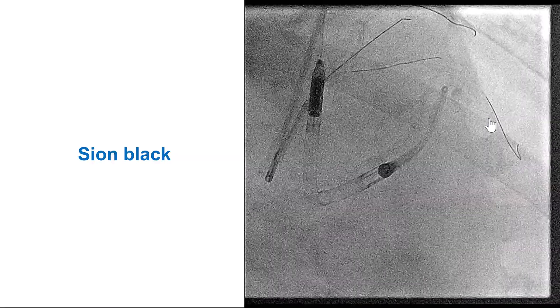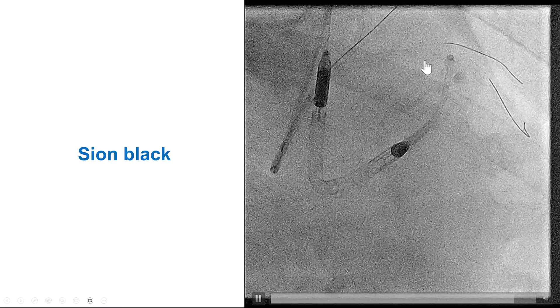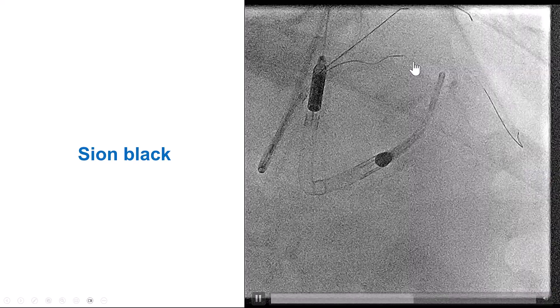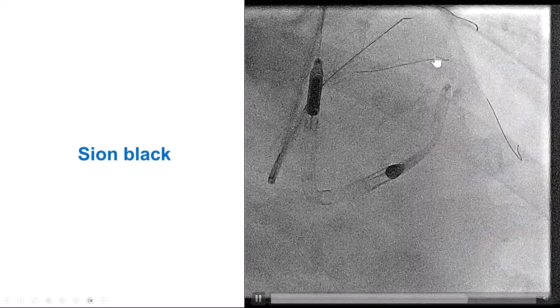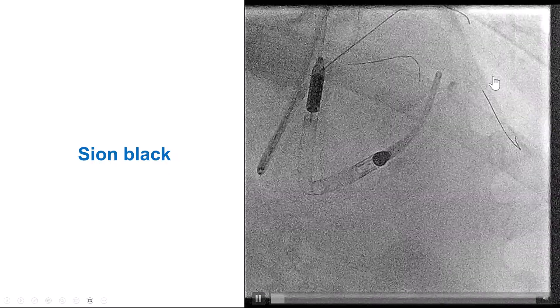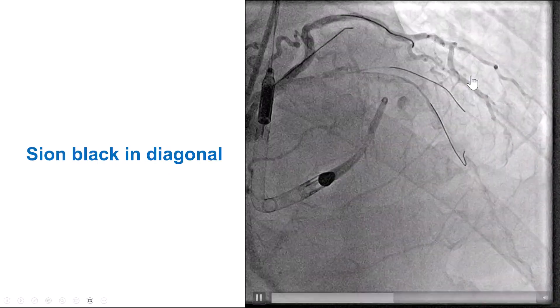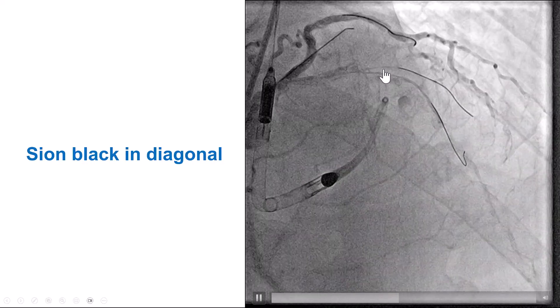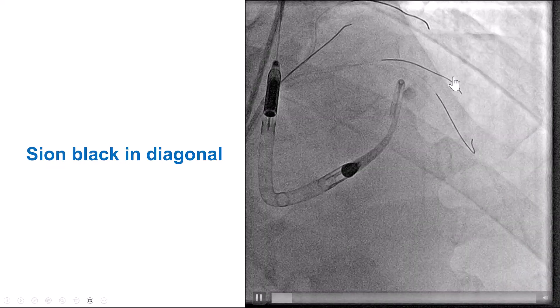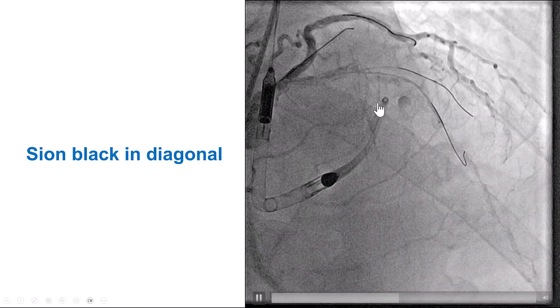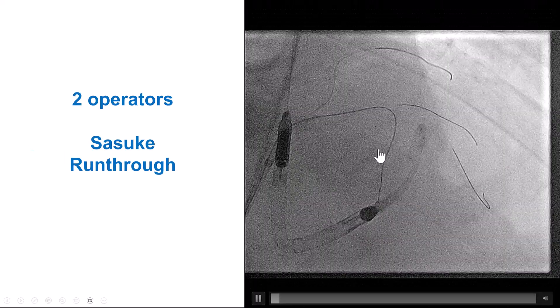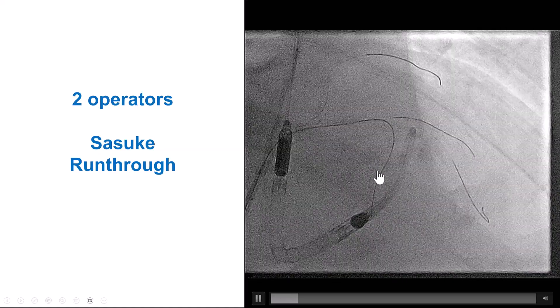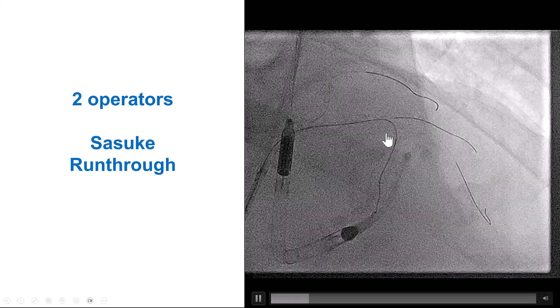At this point, considerable time had passed and we were seriously contemplating stopping. Before doing so, we took the wire on the septal and probed gently with it. Fairly quickly, the wire buckled for a second and then found its way into a branch that looked like a diagonal branch. When we checked with contrast, we confirmed we were in a small diagonal branch located at the distal cap — we had a wire into the true lumen in the diagonal. We were then able to place another wire back into the original septal, giving us true lumen in the diagonal and true lumen in the septal.